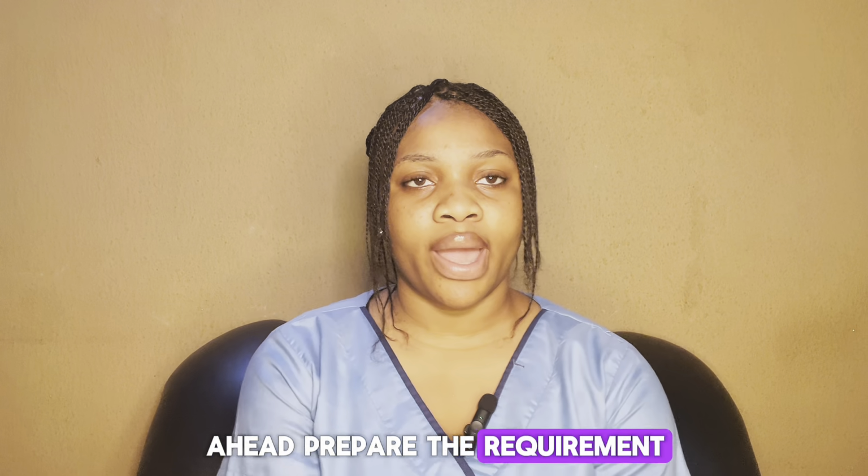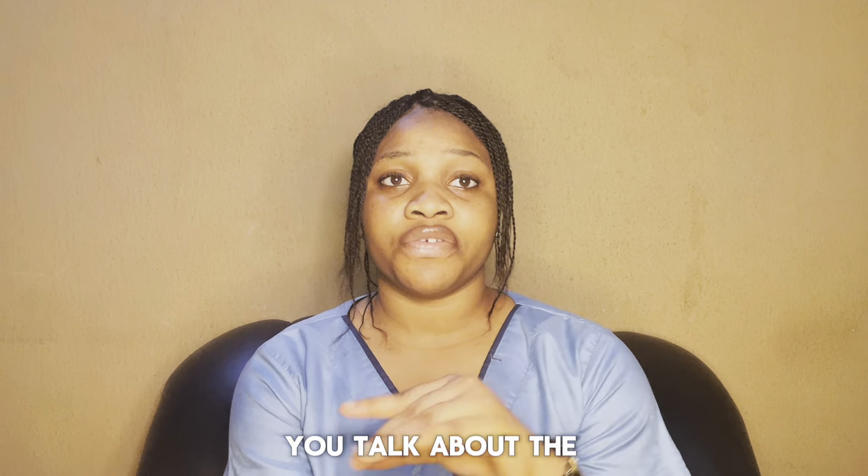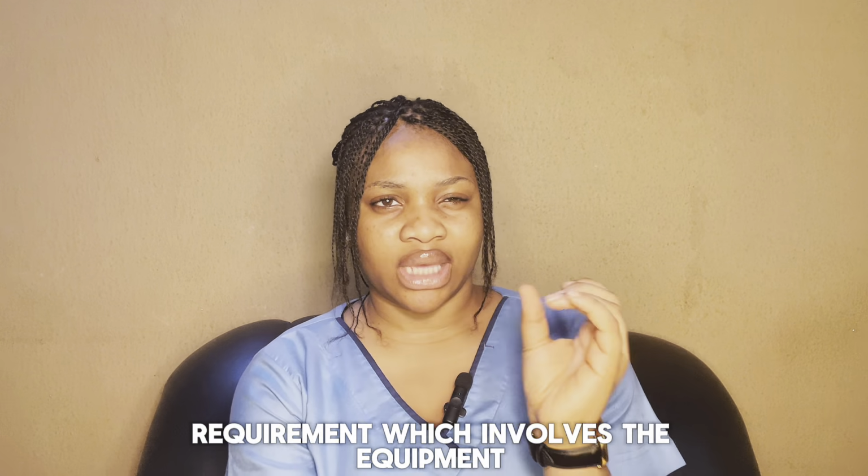prepare the requirements. In this preparation, we talk about the requirements, which involve the equipment you are going to use to carry out the IV cannulation. I was able to get a few pieces of equipment to show you all, but there are some that I could not get, which I'm going to improvise with other things. But I'm going to try as much as possible to put the real equipment pictures on the screen so that you can know the difference between the improvisation and the equipment. So let me get my equipment so you can see.